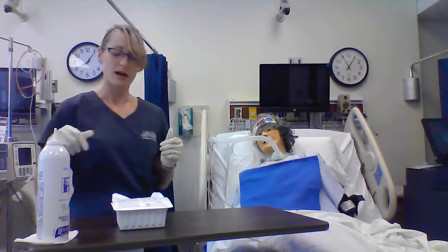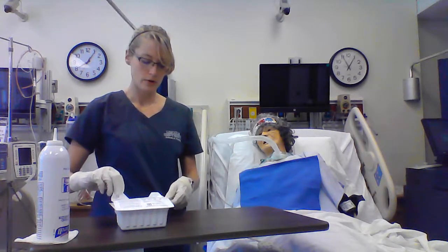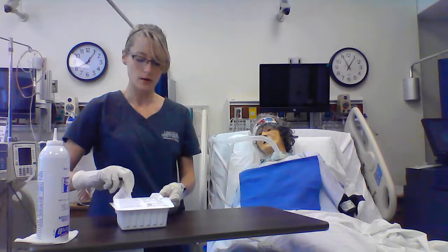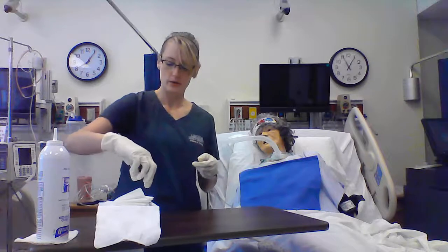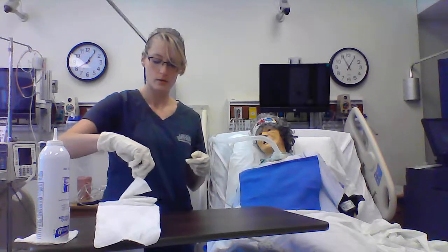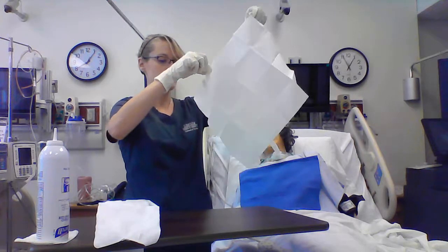So I perform hand hygiene. I like to clean my hands before I open this. I'm going to open it away from me. Set up a sterile field for me to work with. Minding my 1-inch borders here to keep everything sterile.